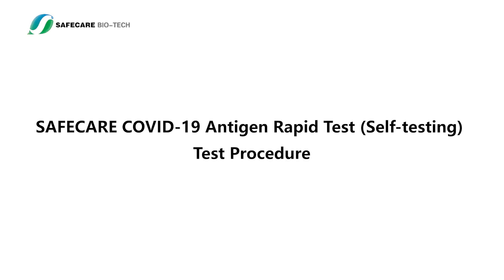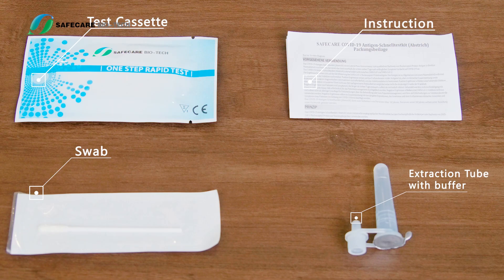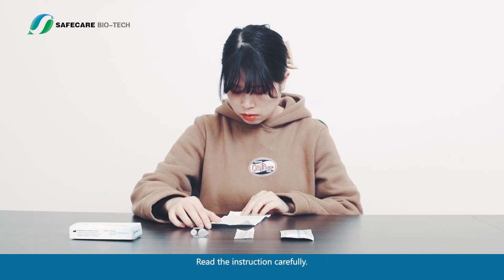SafeCare COVID-19 Antigen Rapid Test Self-Testing Test Procedure. Open the kit box and take out all the components before use. Read the instructions carefully.